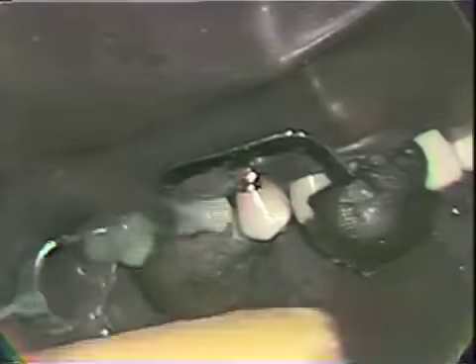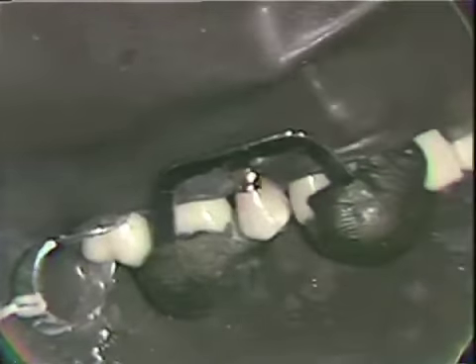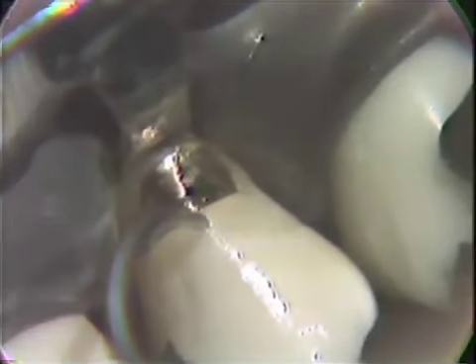So that we can get a better view of the margins and the contour of the restoration. We can see then that the restoration has certainly a high finish to it, that their margins are appropriate here as far as straightness is concerned.